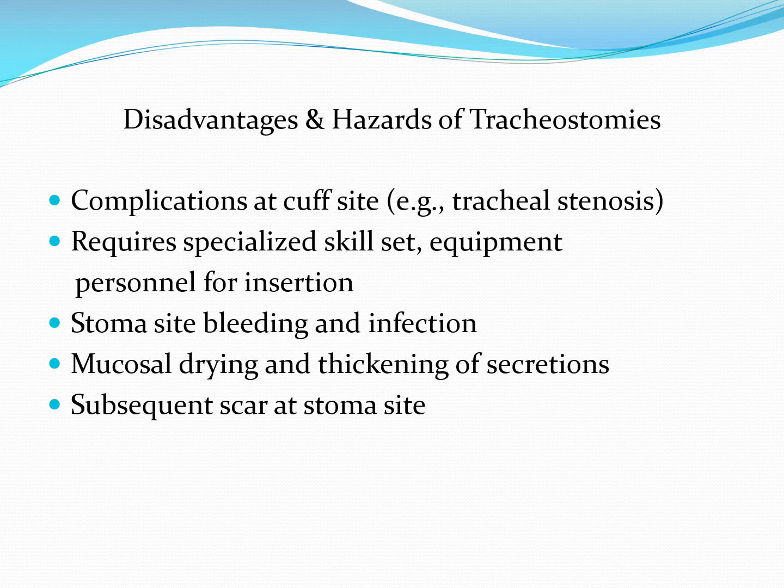Just as there are advantages and indications, there are also disadvantages and hazards. Some of those relate to complications at the cuff site, including tracheal stenosis, particularly for cuffs that have been overinflated for a long period of time. They can impose pressure on the delicate tracheal wall, tracheal mucosa, and cause a reduction in blood flow to it, initially causing some softening, but eventually can cause some scarring to happen there.